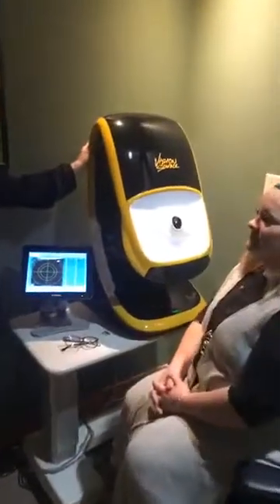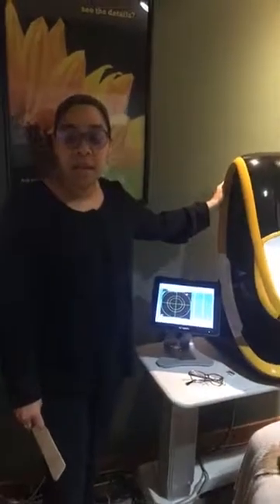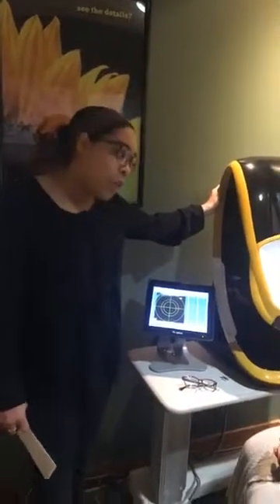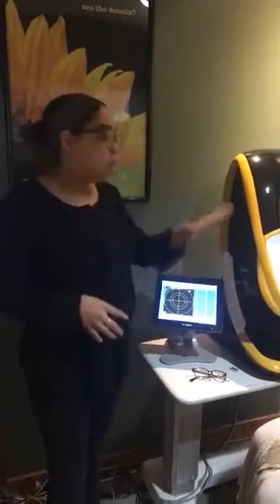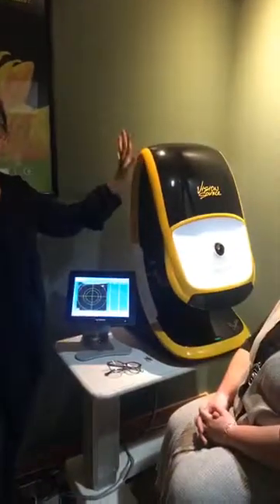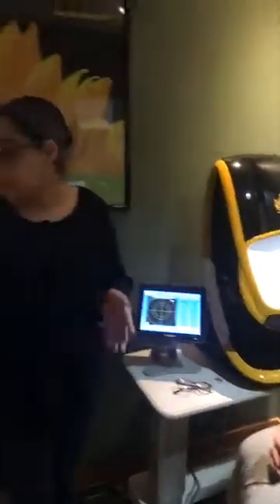For those of you that don't know how it works, or are wondering if it uses radiation or that kind of stuff — this is completely safe. All we do is take a look inside and you're going to see a bright flash. That's all it is. It's like a picture, like a regular picture.